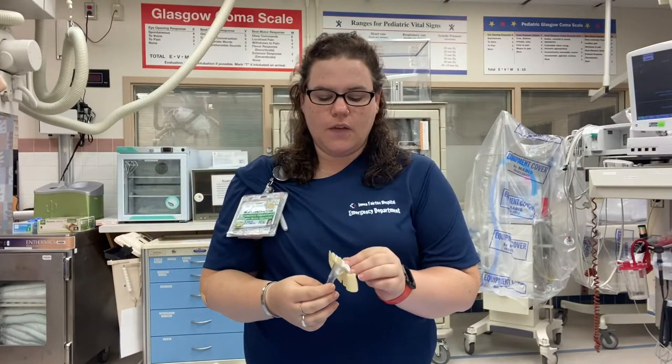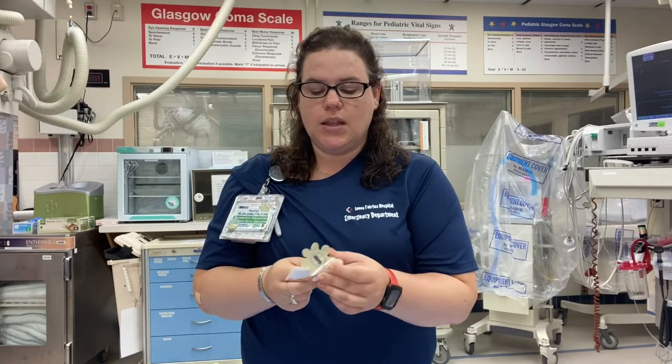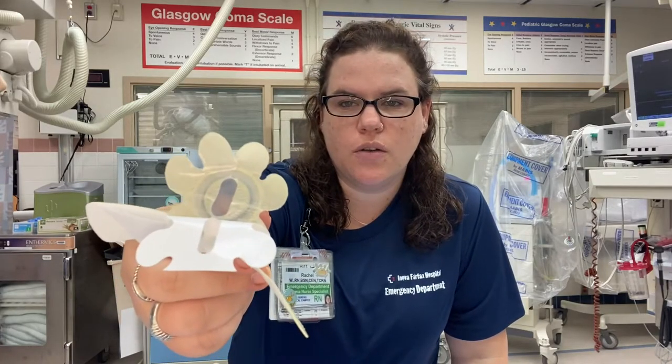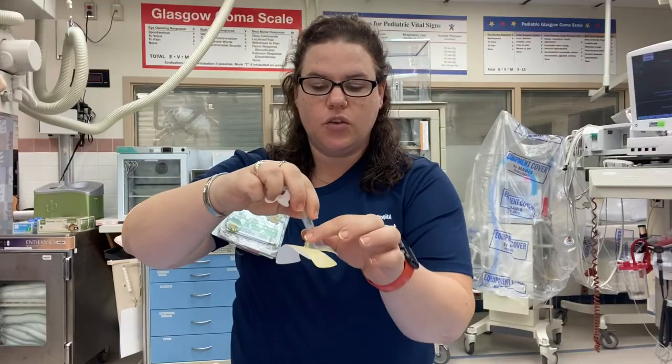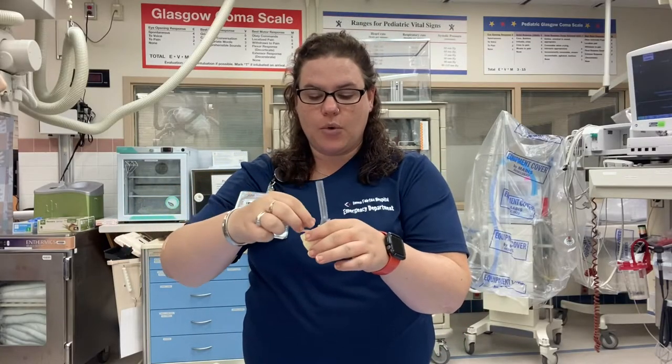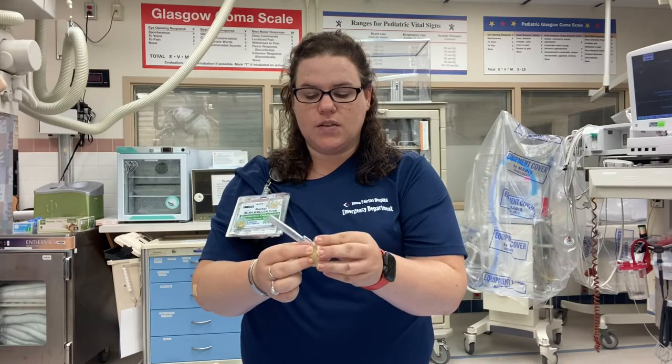This is what the device looks like when you take it out of the packaging. You're going to sit it on the head of the penis with the sticker, making sure that the urethra lines up with the insertion portion. You want to make sure the urethra sits in that little line. Once you put it on the head of the penis, you're going to bring the little petals down like a flower and then wrap the piece around, making sure it's secure.